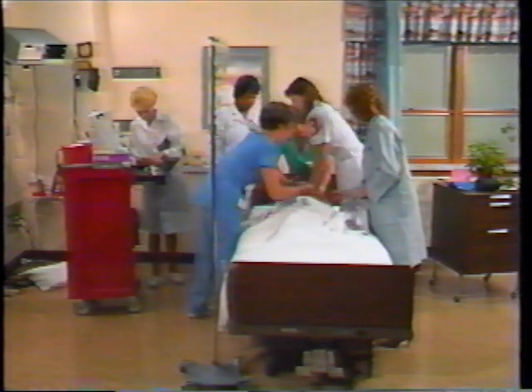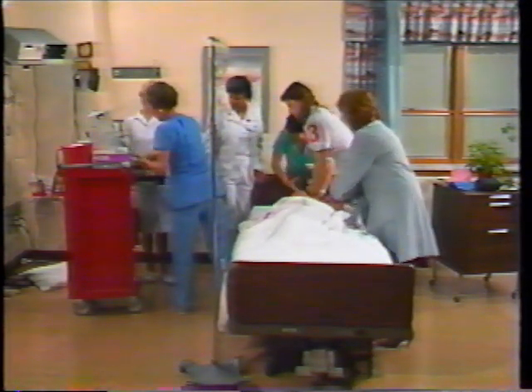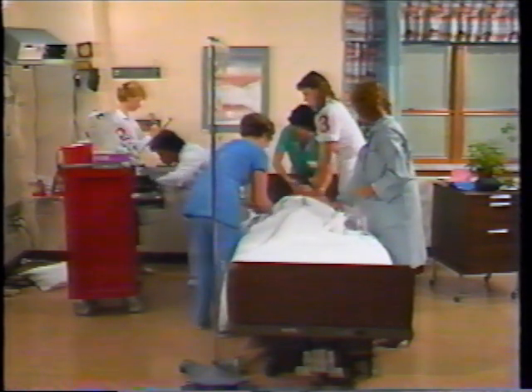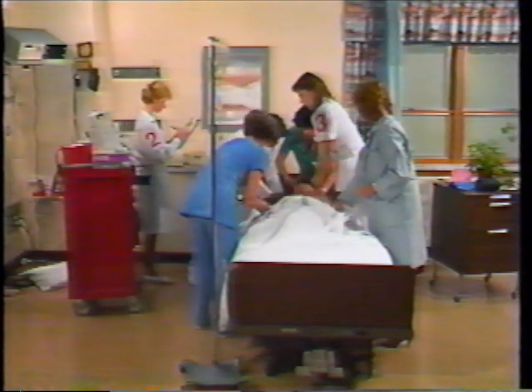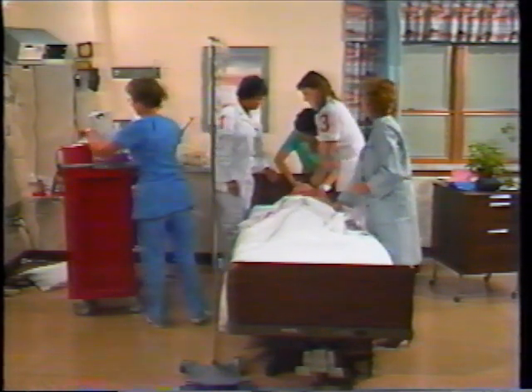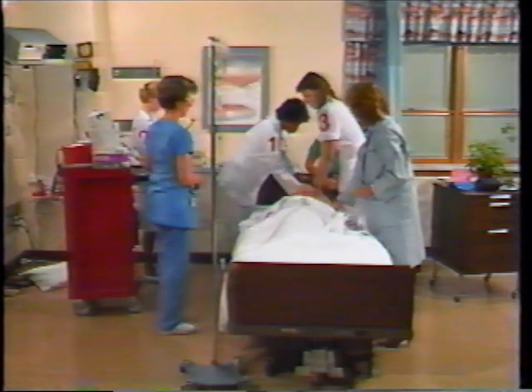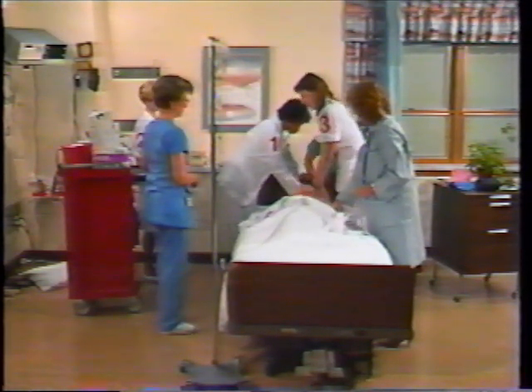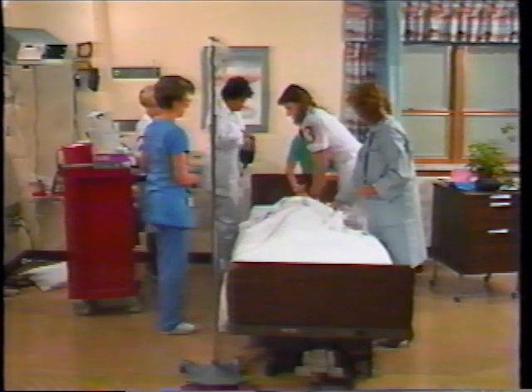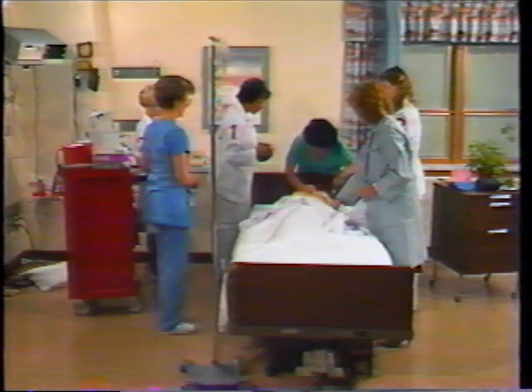1 and 2 and 3 and 4 and 5. Let's get her intubated. 0.5 milligrams of epinephrine IV push. Take over for me, please. 1 and 2 and 3 and 4 and 5. Hold it for a second. Okay, it's in.